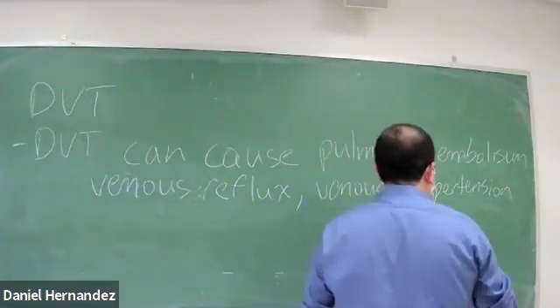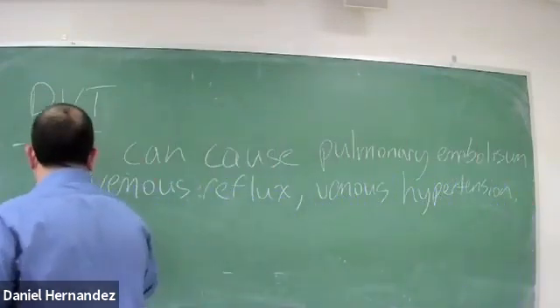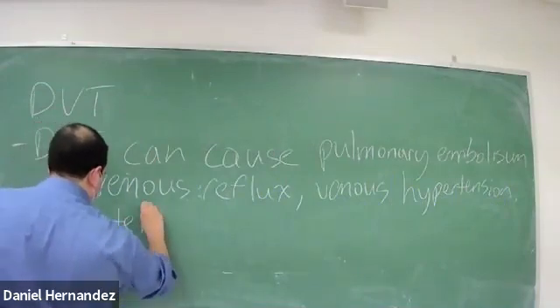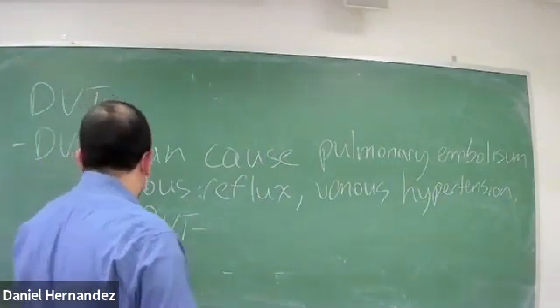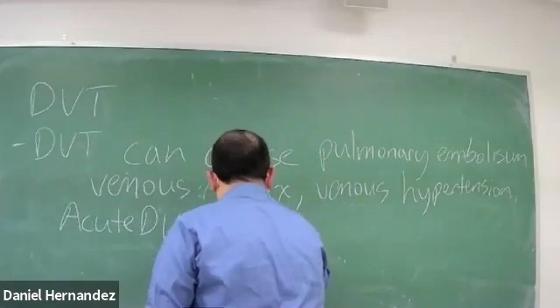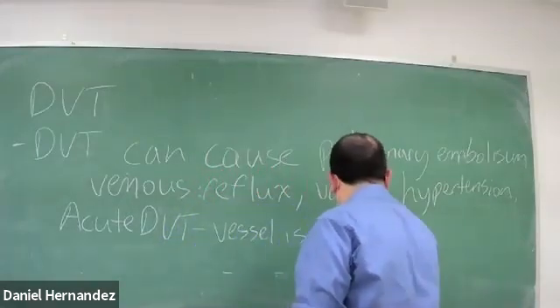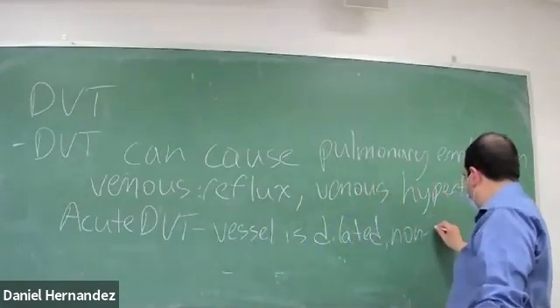So acute DVT. Vessel is dilated. Non-compressible.